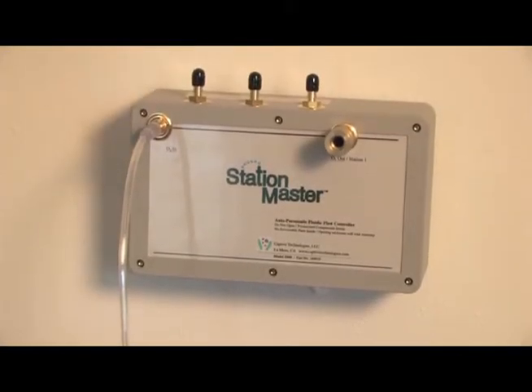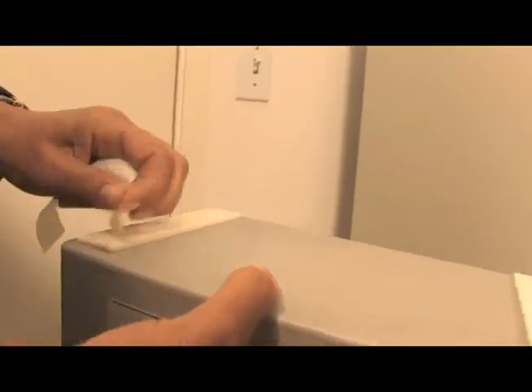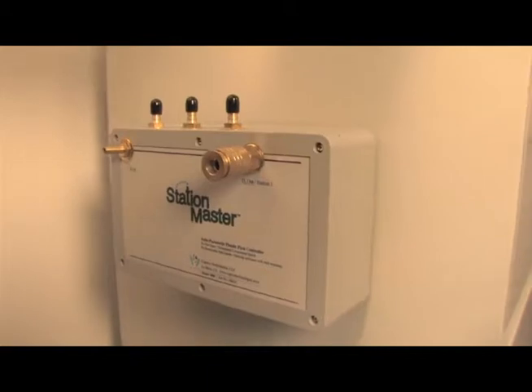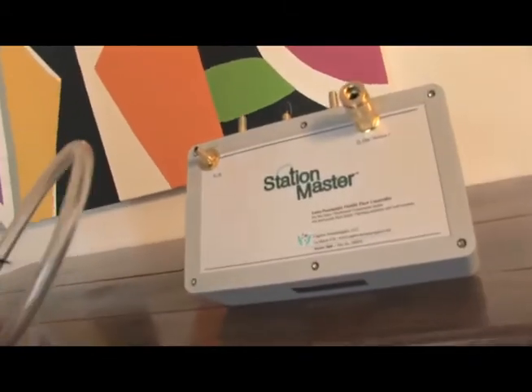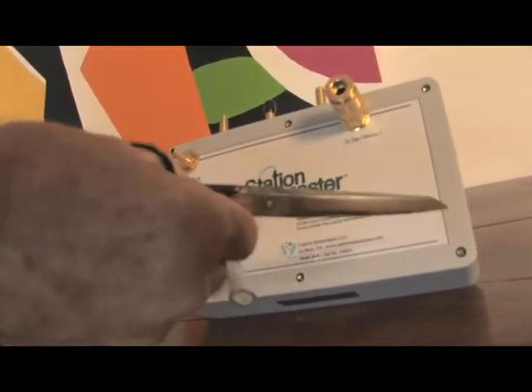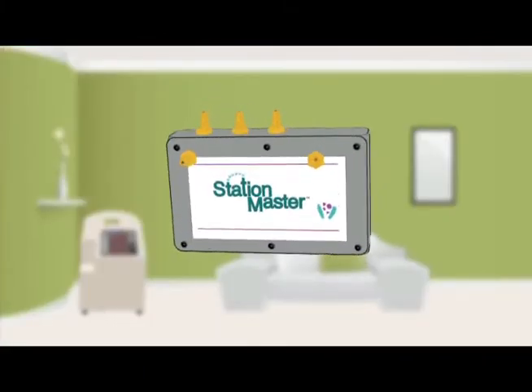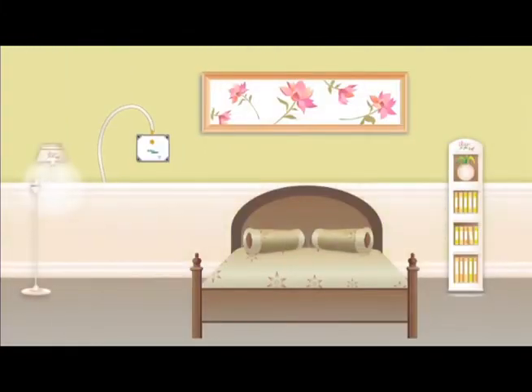Best of all, it's a breeze to install. Self-adhesive strips hold the controller and the outlet stations in place with no holes in the wall. All you need is a pair of household scissors to cut the flexible pipe that runs from the controller to the oxygen stations. You can route the pipe out of the way, behind furniture, along carpet edges, baseboards, and door moldings. Some even routed through basements or attics.